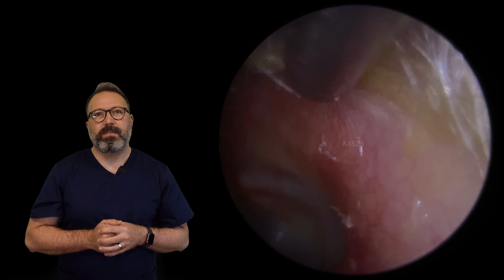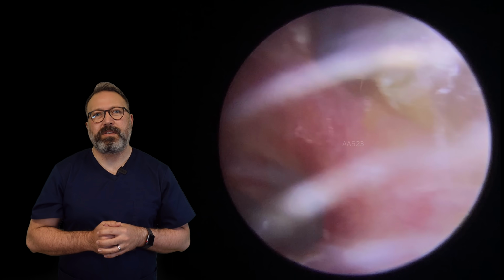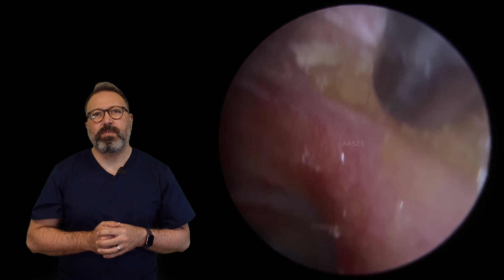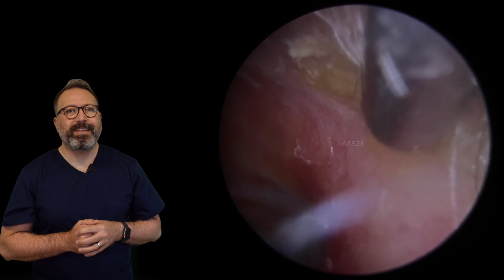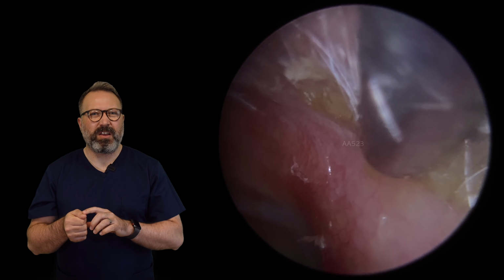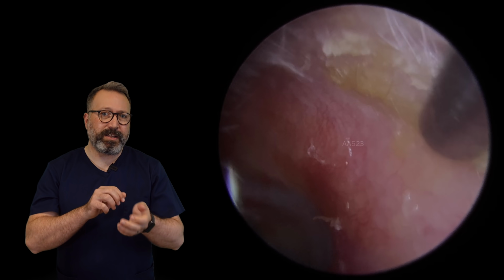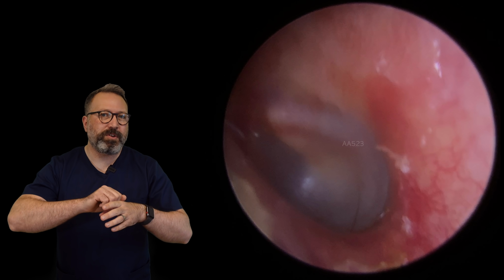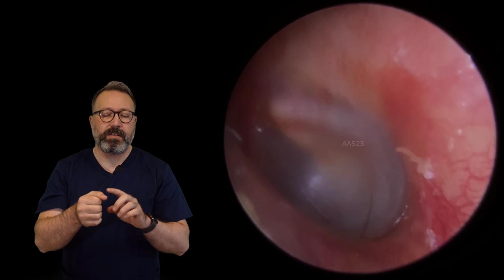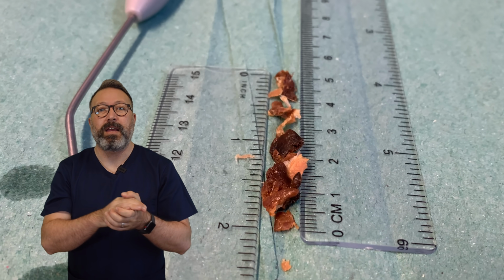Gosh, this is a really tough layer of skin here at the top. Now this is either going to come away really easily. One thing you want to be careful of here is risk of bleeding. So when you're peeling skin, if you've ever had a pull at the side of your nail and you pull it and it just kind of goes halfway up your elbow, that kind of thing can happen in ear canals. And when you pull it, it can go across the surface. The difference is the blood vessels are really close to the surface in the ear canal, so it causes a little bit of bleeding.